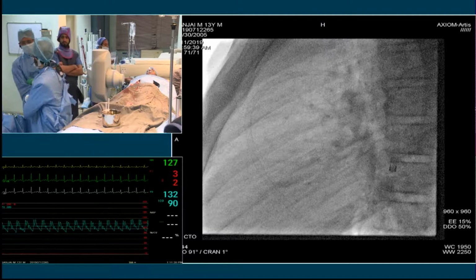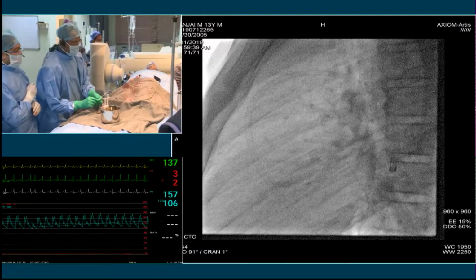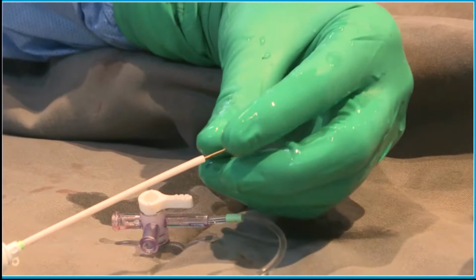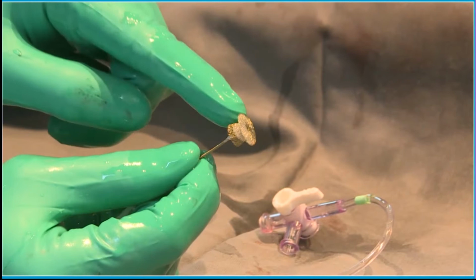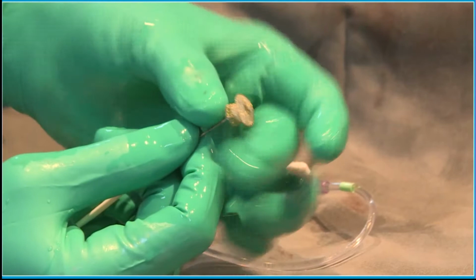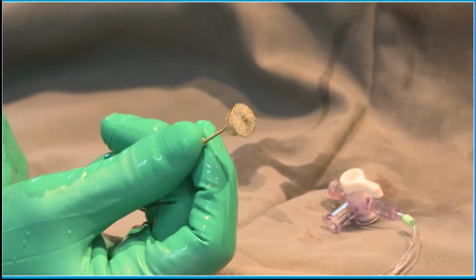Okay. Is that based on what's available on the shelf? Yeah, exactly. There are other devices available also, but we would like to go for Occlutec. So we can see the Occlutec is a little different from other regular ones, like LifeTech or Amplatzer. Can you see the focus here? Yeah, we can see it. He's showing. You can see it's a reverse coning. 8/6 means 6 is close to the aortic side and 8 is on the pulmonary end. What the company claims is that this decreases the chance of mobility or instability of the device. Okay? So any doubt in that?